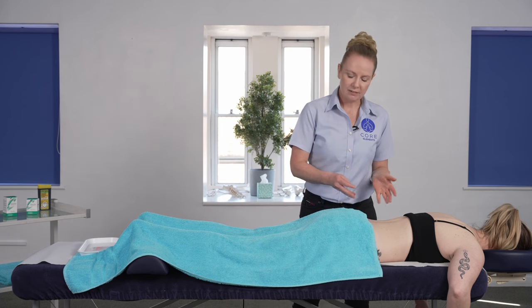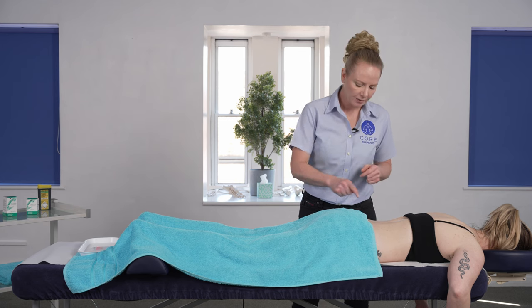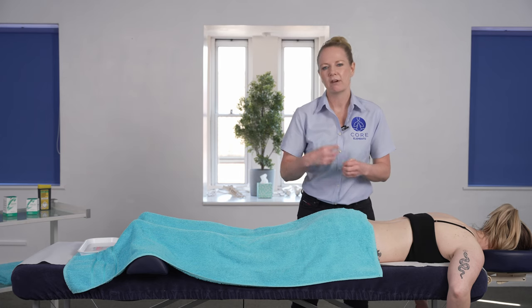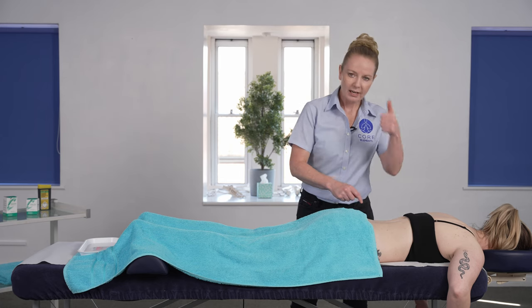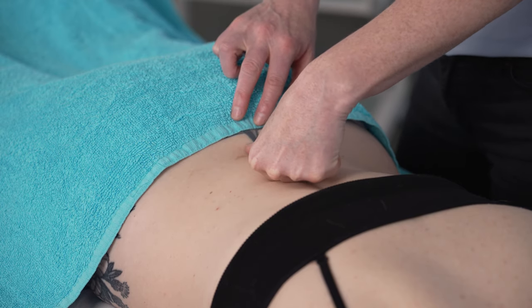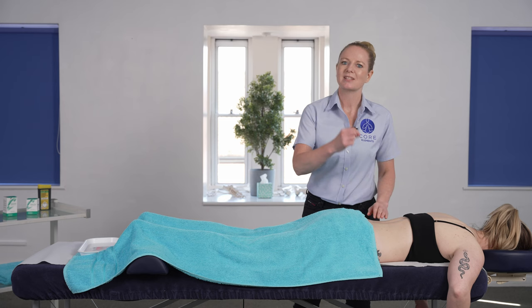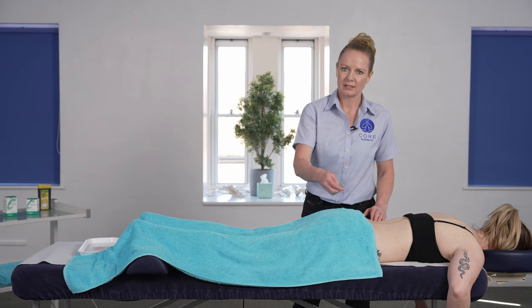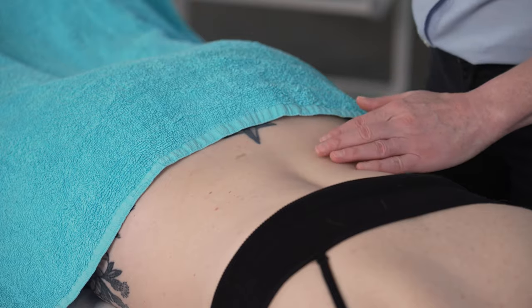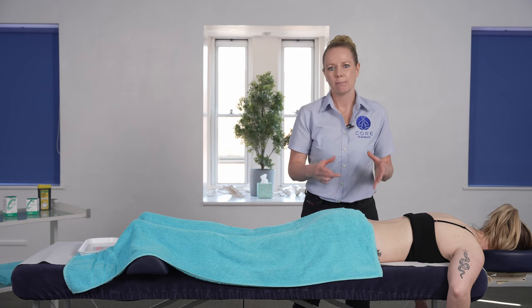For the purposes of this video we're focusing on dry needling to the erector spinae group. A good technique for trying to identify the muscle, especially in clients where it might not be that visible, is to take the thumb onto the spinous process and then roughly measure out about one to one and a half thumb widths away from the spinous process. The needle is then going to angle back towards the spine, angling towards that transverse process which is where the muscle attaches.